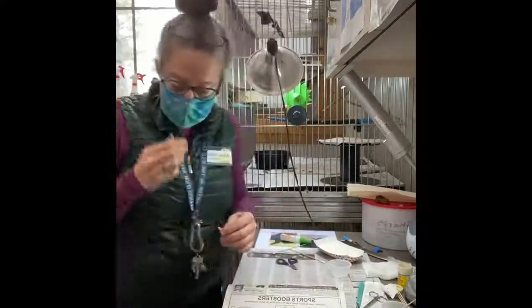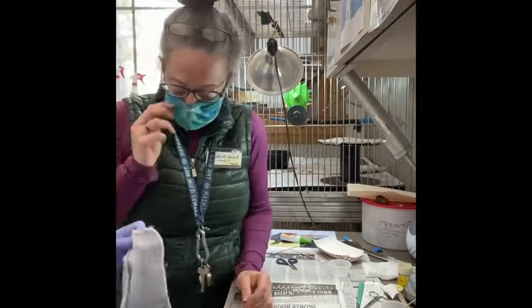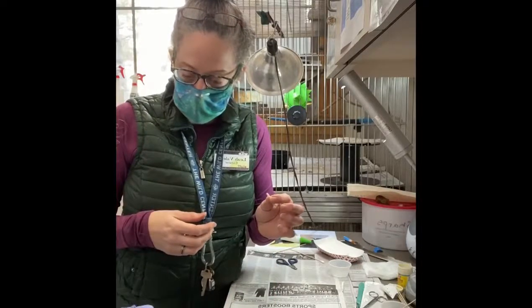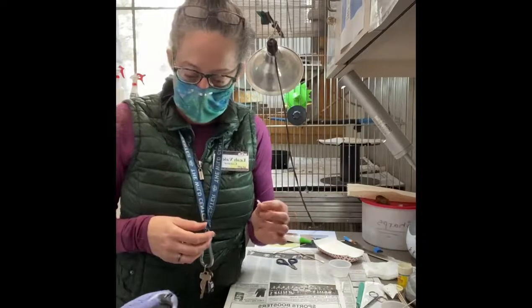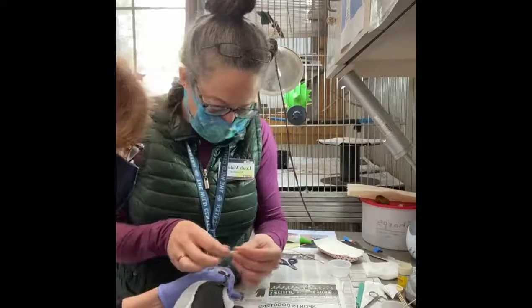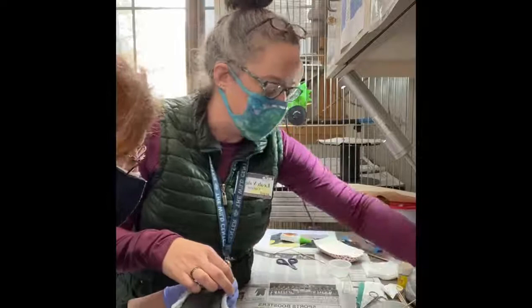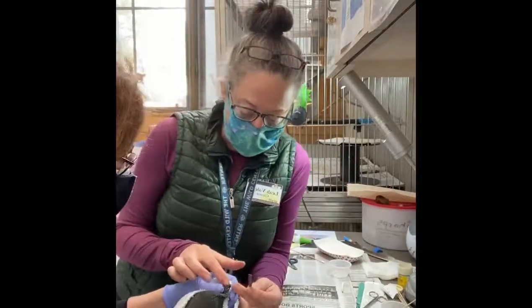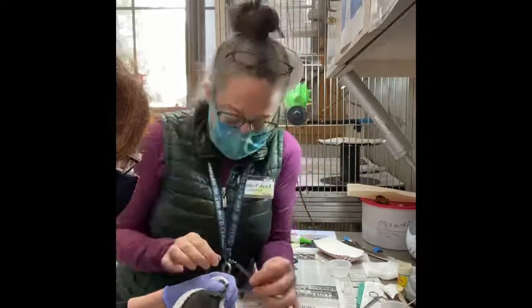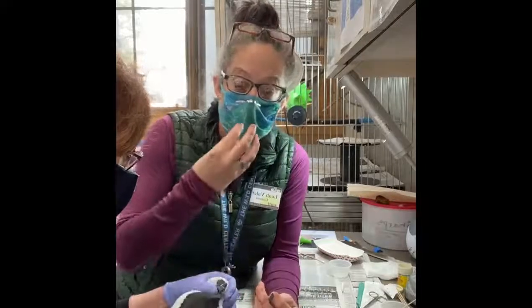What I want to do first is see how much of this feather shaft I need to use before I start pouring glue out. So the other thing that we have happening with her beak — because she broke the very top tip — it's now starting to grow crooked. We're not really sure why, but when she broke it, she may have damaged the way it grows.